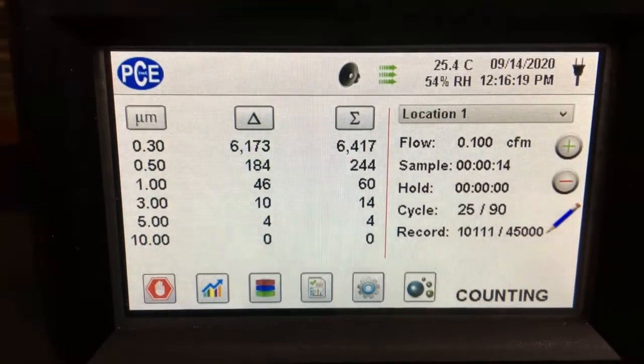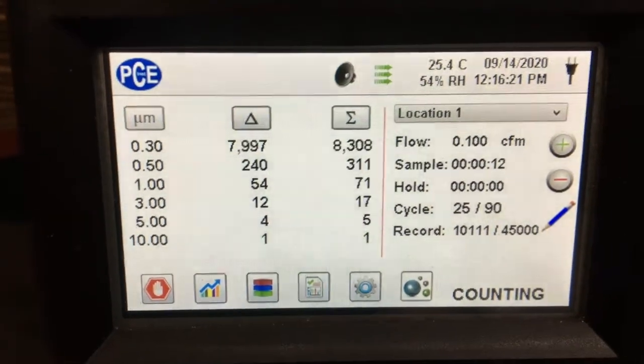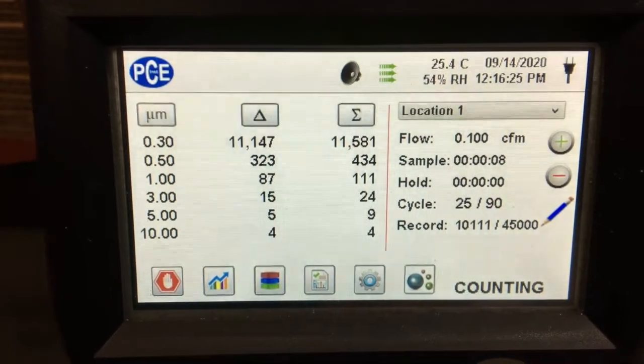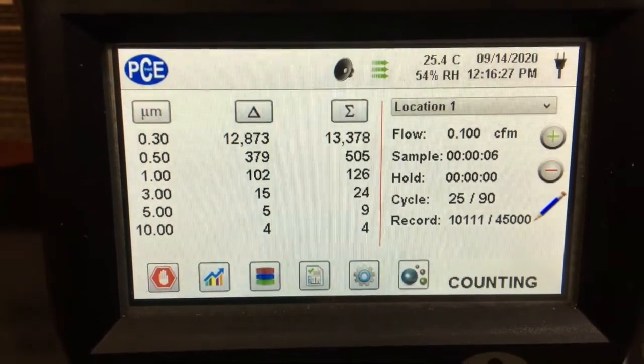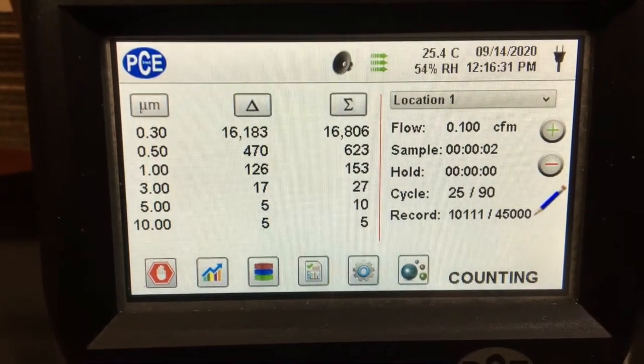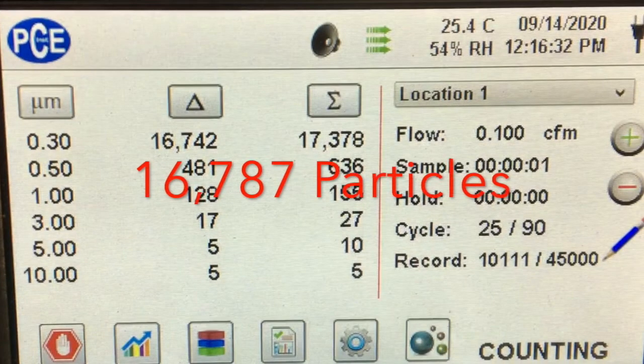Here's a video of us testing the air through our PCE particle counter, and we got an average of about 16,787 particles. This is much higher than our office average, which was between 1,000 and 3,000 particles per liter, but that's to be expected — this was an active warehouse where they're shipping containers worth of PPE out to the country.